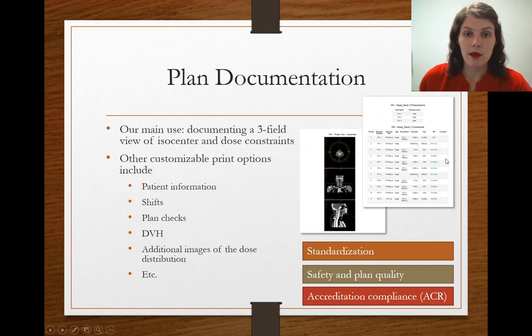So even with our limited use of the documentation capabilities, we've seen improvements in standardizing these documents across all of our patients, increased safety and quality by allowing this quick isocenter check right before treatment, and following the ACR's recommendation to have these objectives printed out for each patient.